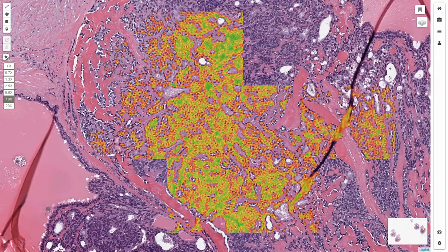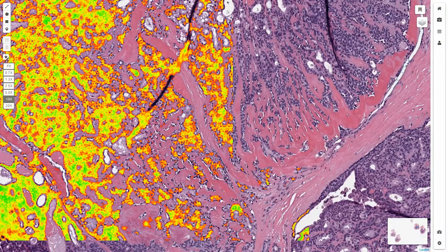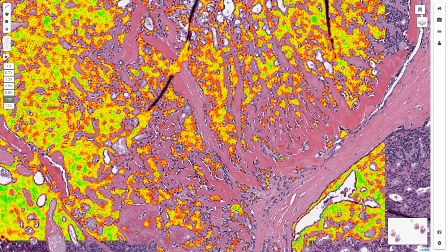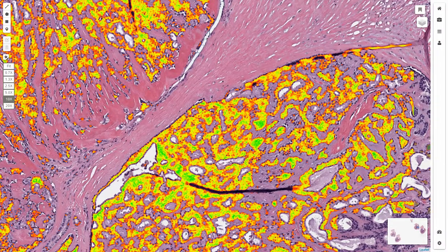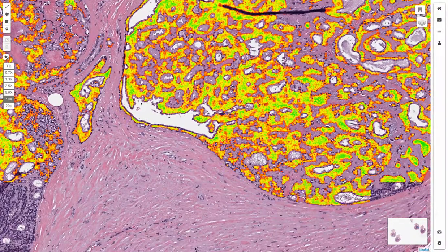I think it is. And we can see now in real time, as I pan through the image, segmentation of the foreground tumor from the background stroma, avoiding the tumor infiltrating lymphocytes, which is of course part of the process of ideally generating ground truth maps that are only the cancer and not additional cell types. Again, some tumor infiltrating lymphocytes have not been called out, again showing the utility and speed with which classification of foreground versus background can be carried out.